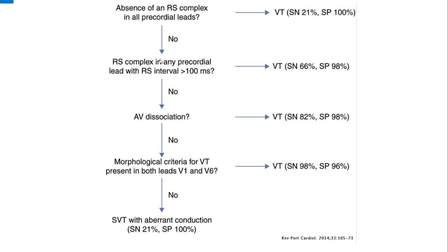The next step is to localize the QRS complex which has R and S waves, and see whether the distance from the R wave to the nadir of the S wave is more than 100 milliseconds. If it is more than 100 milliseconds, it is definitely VT with a specificity of 98 percent. If the RS interval is less than 100 milliseconds, then we have a third step.